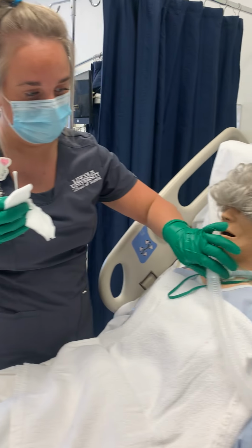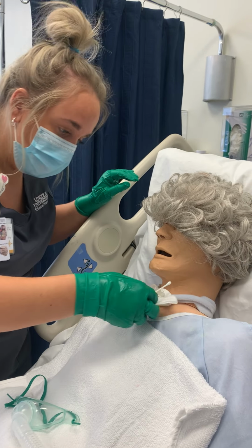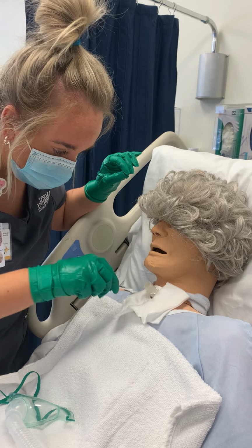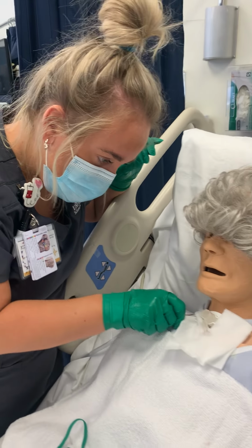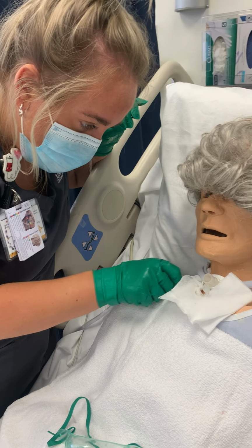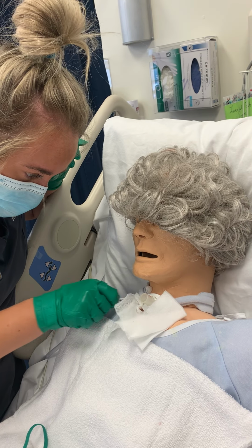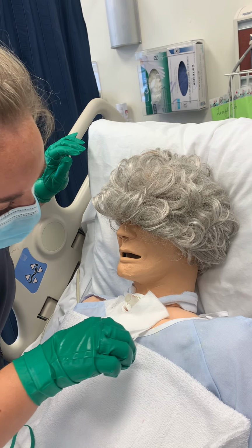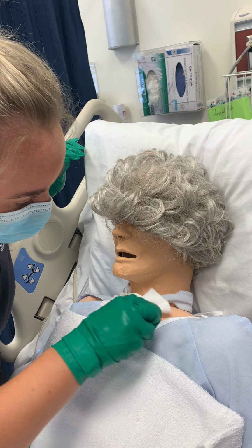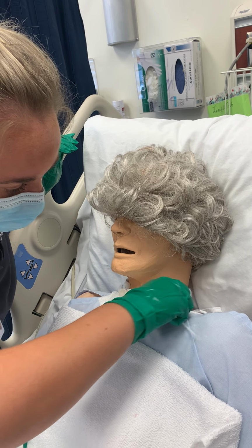I'll just break sterility with this hand. Just gonna make sure I stay sterile around the trach, and then I can go in and fix it once that part is done.